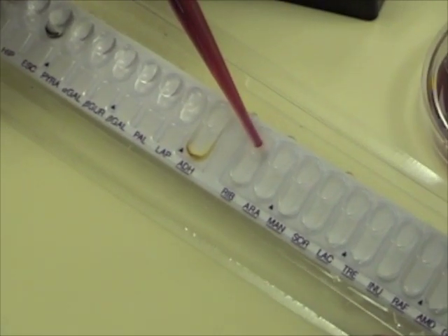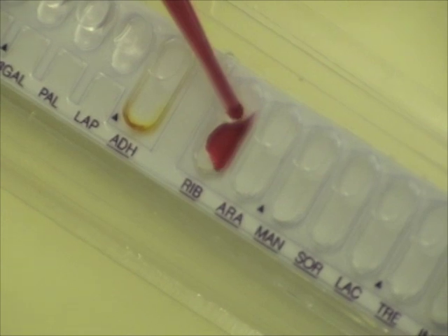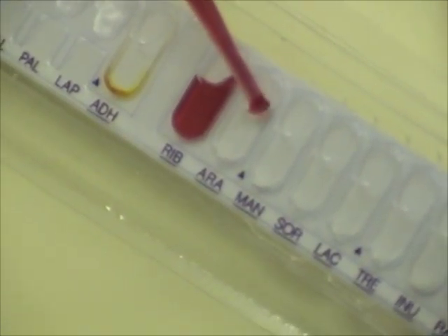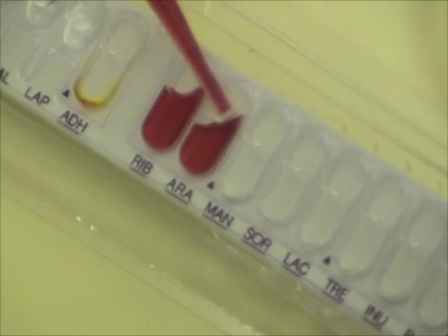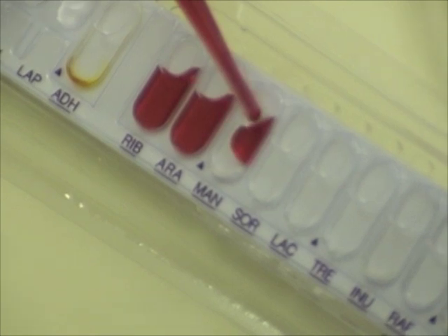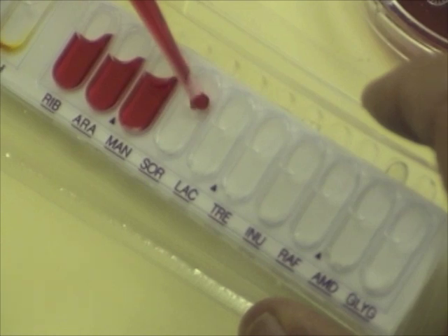Determine whether you have fermentation. Notice that the dye is red — it's a red dye that will change color with pH. So if you have fermentation, recall that you get a drop in pH, and that pH drop will be seen as a color change from red to orange to yellow.